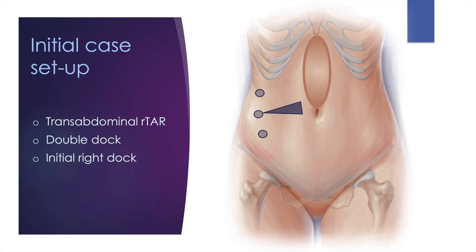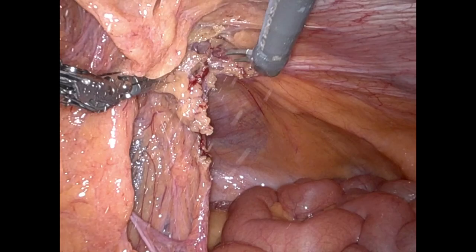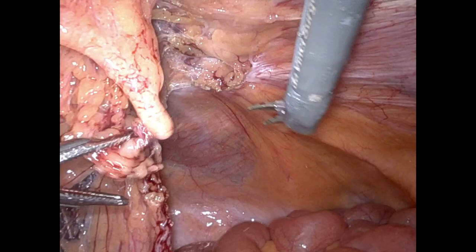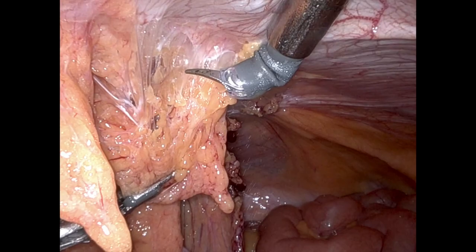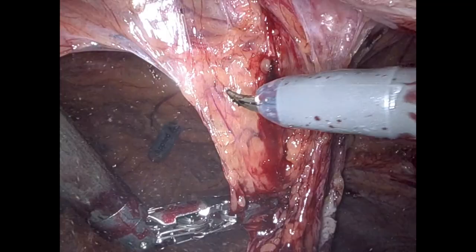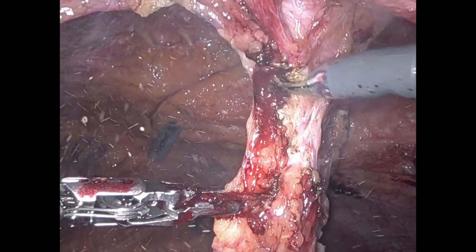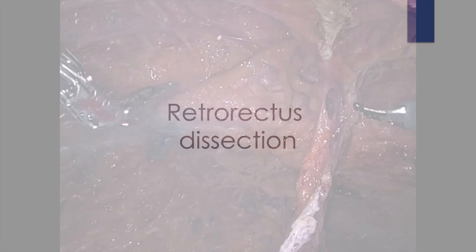For initial case setup, we went in the left upper quadrant, assessed the abdomen, and felt like the easiest approach would be to dock on the patient's right side. We then started with lysis of adhesions, mostly involving omentum, but also some portions of the transverse colon were involved in this hernia sac. Lysis of adhesions took about 45 minutes — nothing too dangerous. The only opportunity for improvement at this juncture was our initial ports being a little too medial, making it a little difficult to perform our dissection.